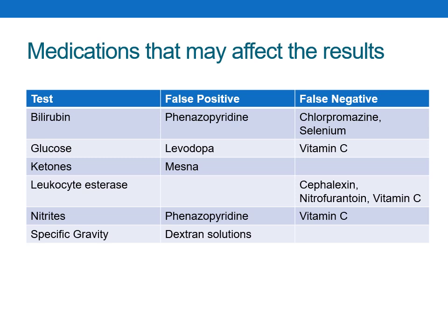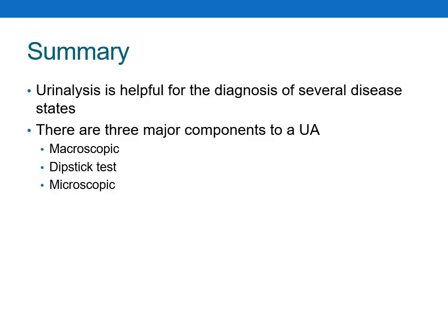So overall, I would say the largest impact could be the false negatives from patients that are regularly taking vitamin C as an over-the-counter medication. This concludes the video.